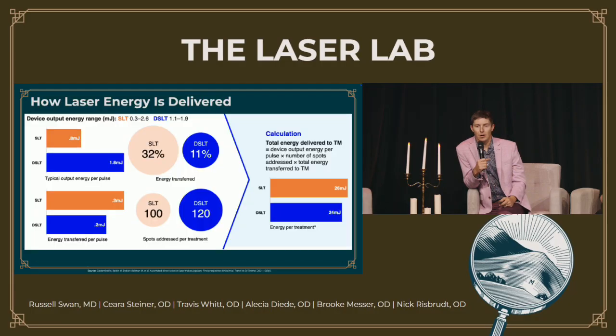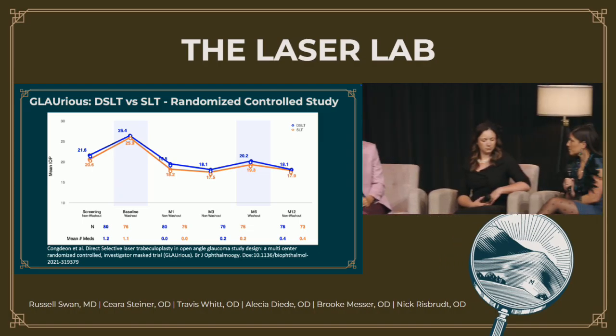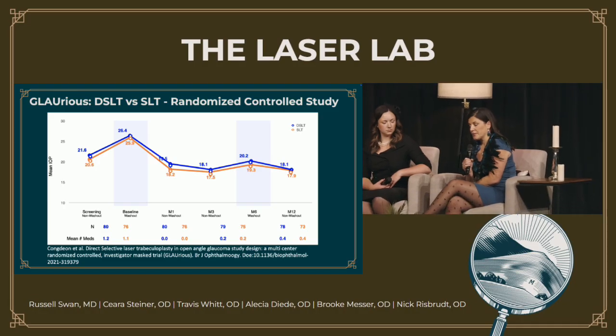And I'm going to throw this one actually to our Fargo colleagues, because you guys have direct SLT in your clinic now. There's been some nice studies that have shown similar efficacy between direct SLT and regular SLT. Brooke, can you talk about the patient experience with direct SLT, what your initial impressions have been so far? Yeah, the patient experience is really nice.